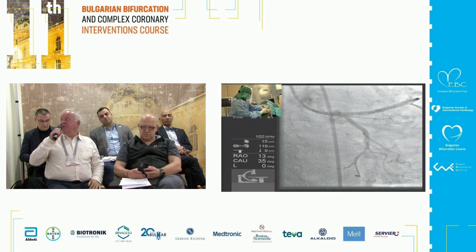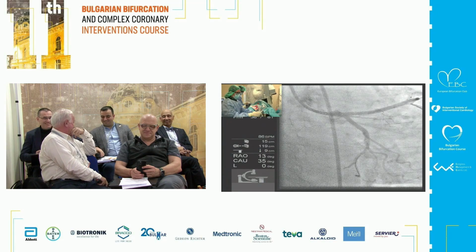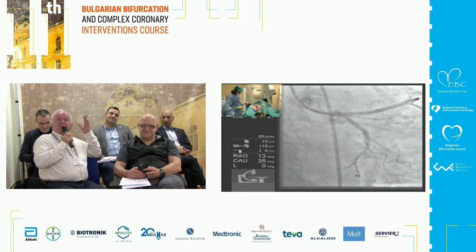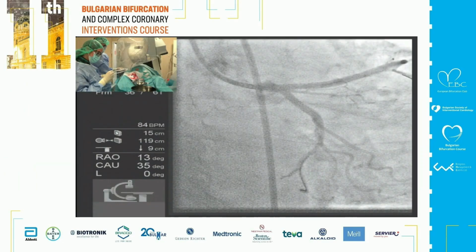And of course, it will be very interesting to have an IVUS. Now we will do the IVUS to confirm the theory, to see if they're really well opposed. Instead of using the IVUS to plan the treatment, let's use the IVUS to see whether it confirms the practice. George, I've never said that I'm absolutely sure that all the patients are treated like this, but I had a full apposition. I try to do this proof of concept with IVUS.